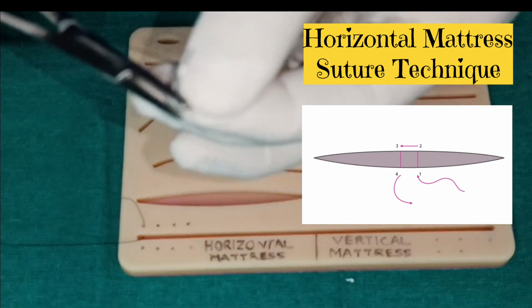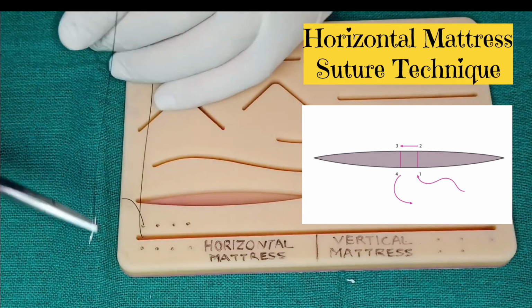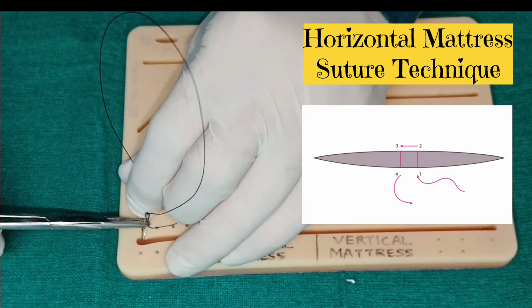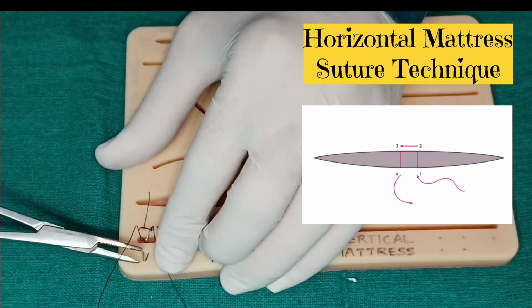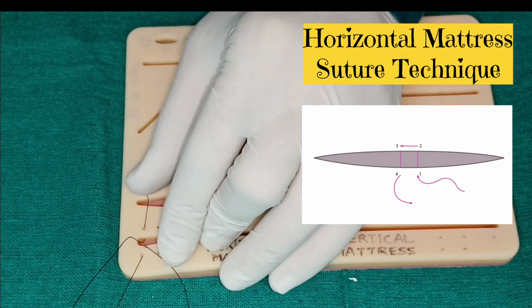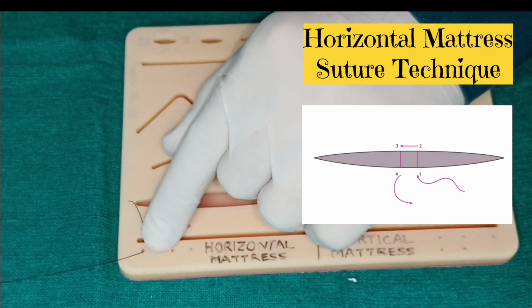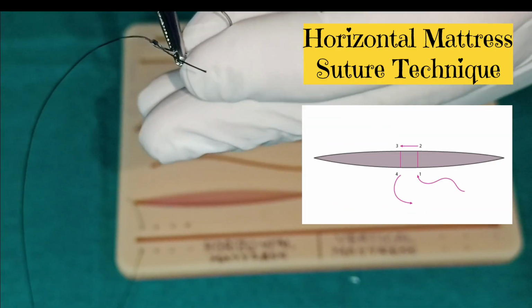You have to push the needle through each wound edge separately, as you can see in this video. After making an exit point, you have to reverse the direction of the needle in the needle holder.